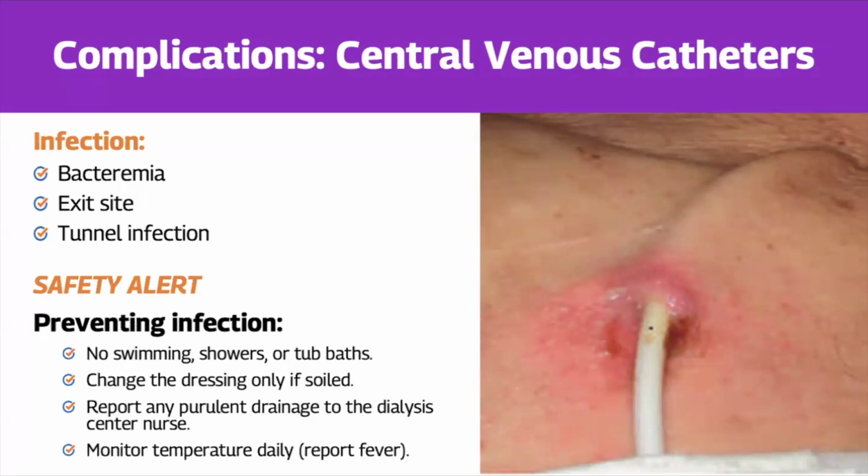Hemodialysis catheters should not be used for blood draws and medication administration outside the dialysis center. And because of the high risk of complications, catheters should only be used when necessary for the shortest time possible.